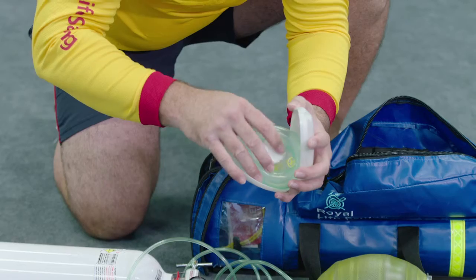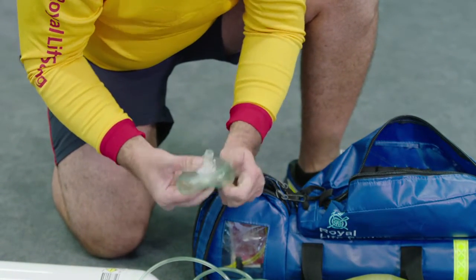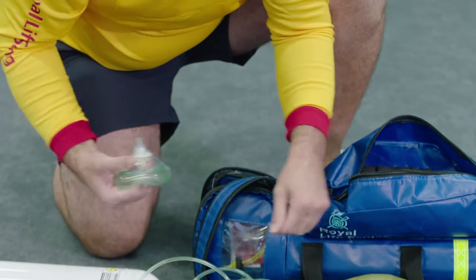A resuscitation mask is used when the casualty is not breathing normally. A therapy mask is used when the casualty is breathing normally.